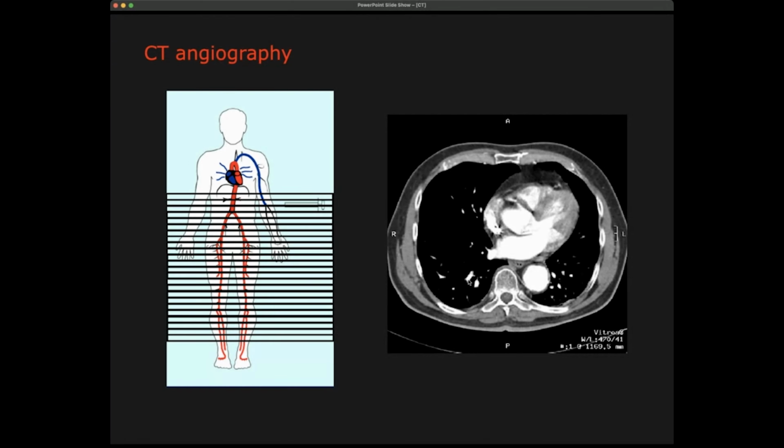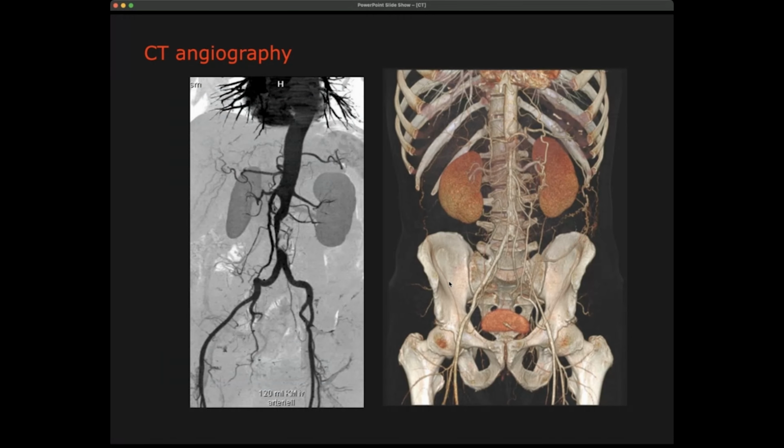And if we make one cross-section, what you see is, of course, a cross-section through the different vessels. So here you see we go through the aorta. This is also part of the aorta. So you cut it twice, of course, at the level of the heart. You see blood within the heart, you see it's bright. And then within the vessels of the lungs, you see blood.